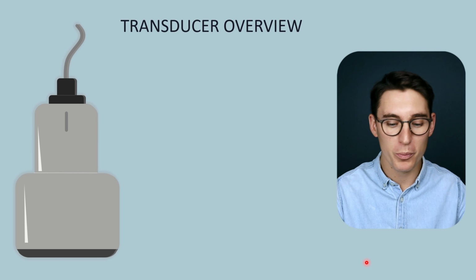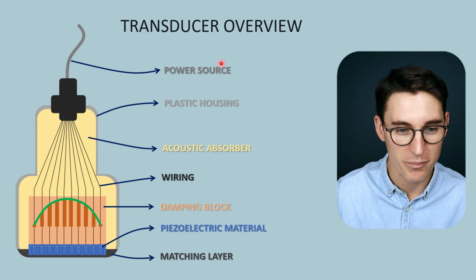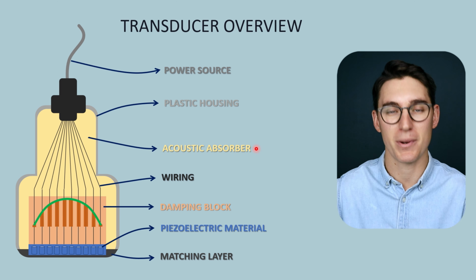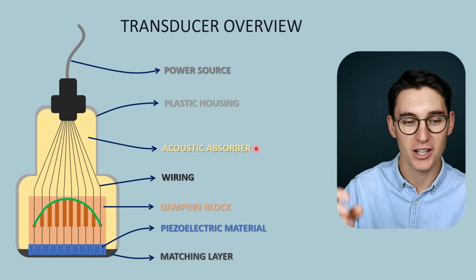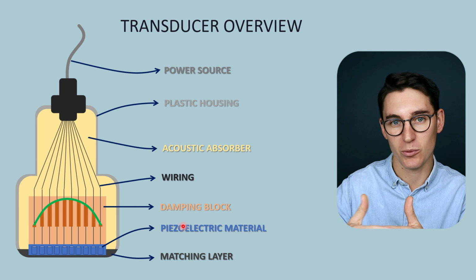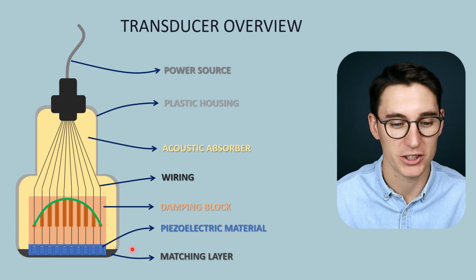If we were then to open up this transducer, we can see that there are many different components within the transducer itself. We've mentioned the power source and the plastic or metal housing. Then there's what's known as the acoustic absorber. This is either plastic or cork, and it prevents vibrations from the operator from affecting our ultrasound machine, as well as stray vibrations from the ultrasound machine where we are creating our ultrasounds from propagating within the machine. It attenuates all of those vibrations.